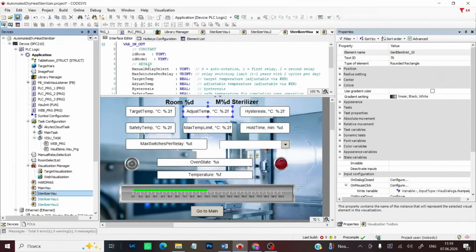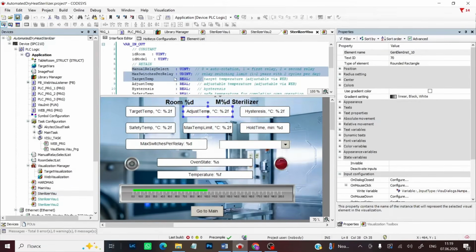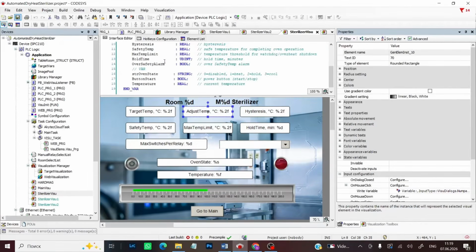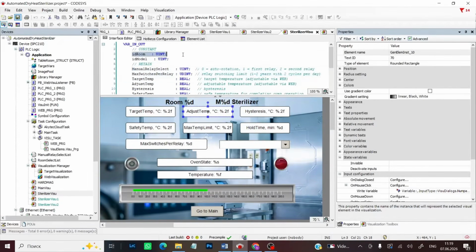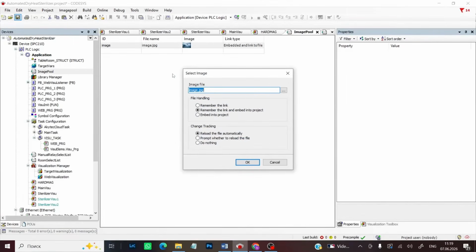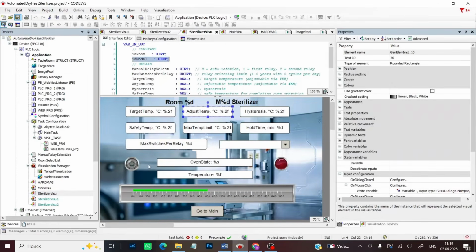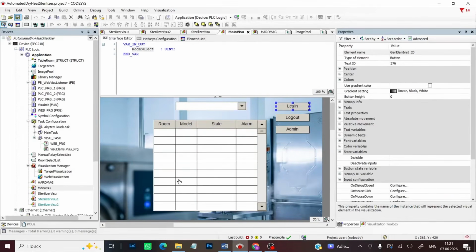First, in the Interface Editor tab, I added variables that are linked to our components. All the variable names should already be familiar to you from previous videos, except for 2 new ones. These are the unique number of the medical facility room and the unique number of the sterilizer model in that room. Next, in the Image Pool component, I added an image and set it as the background for our visualization. After that, I created another visualization that will be displayed to users when they first connect.